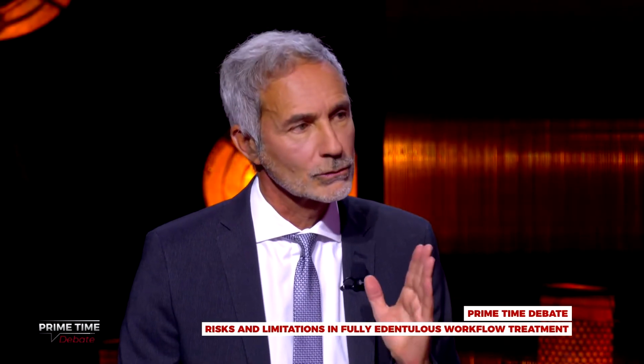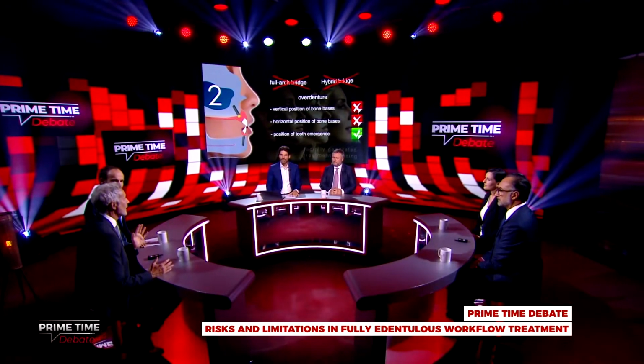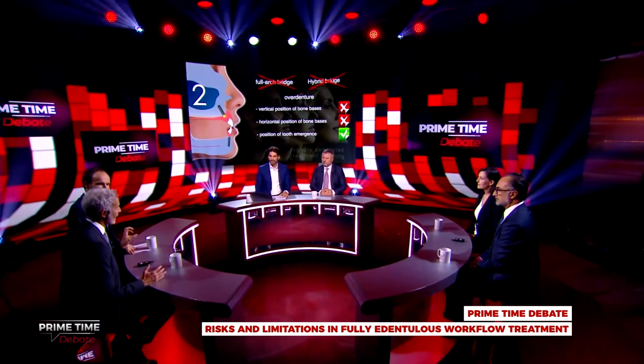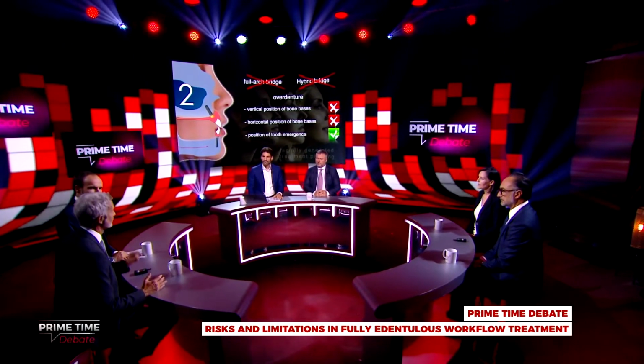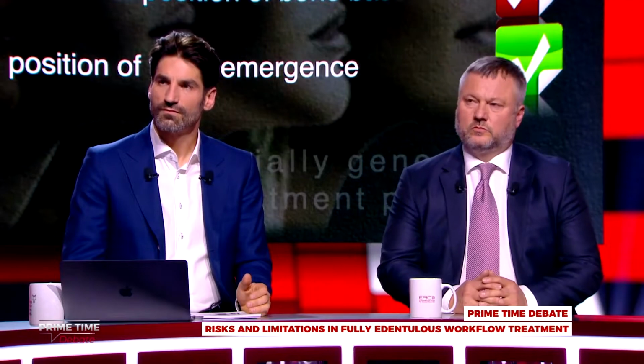And this is important to understand, because even if sometimes the patient asks for a fixed rehabilitation, sometimes the best solution for that specific patient is a removable one. This is the thing you have to figure out in a detailed, meticulous try-in or setup phase, actually to visualize that point for the patient.